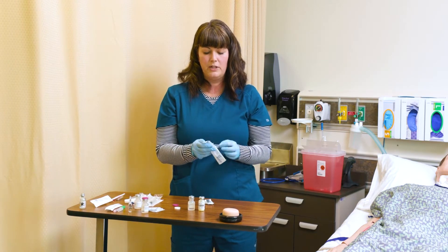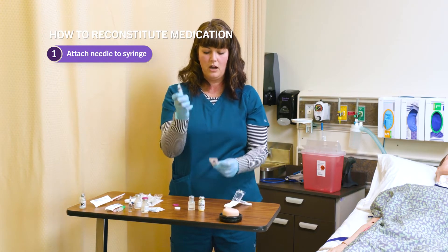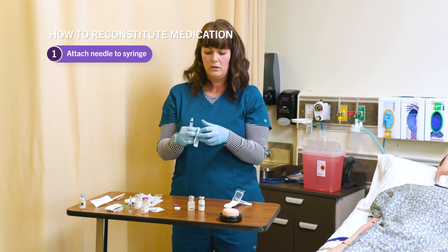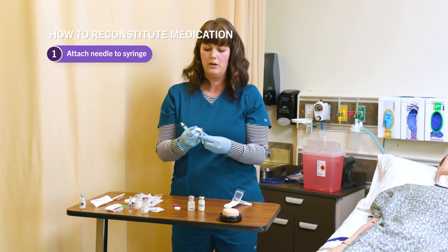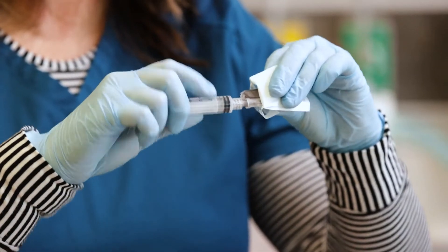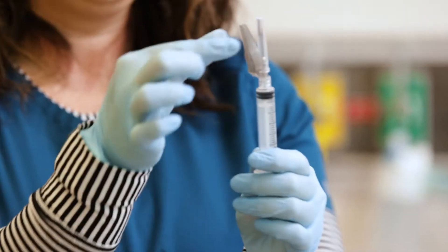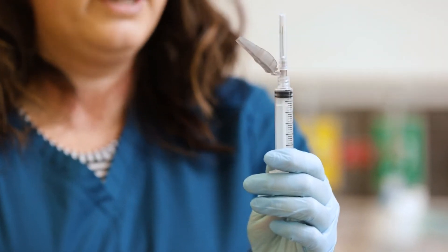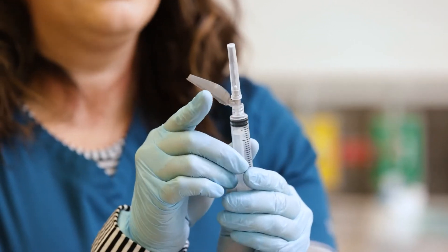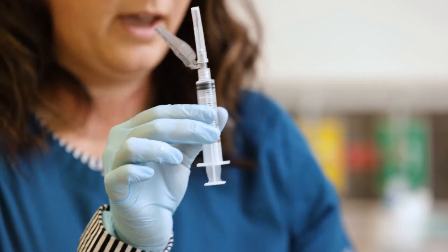First things first, I'm going to attach my needle to my syringe — a needle with a Luer-lock tip, making sure it's compatible, which most needles you find in facilities are. I screw that on all the way. This needle looks a little different — it has a safety feature. When I unsheathe this needle and give the injection, I click this over to cover the needle. For now, it stays right there.